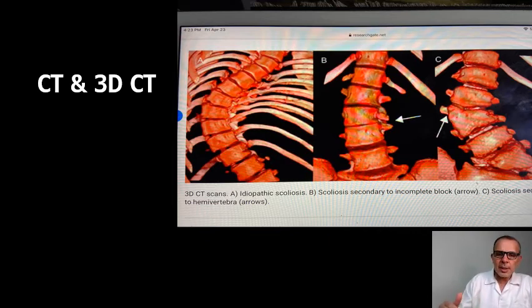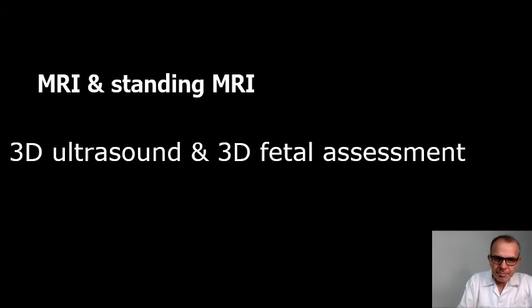All these nasty deformities or congenital disorders could be detected perfectly and evaluated by the 3D CT scan.